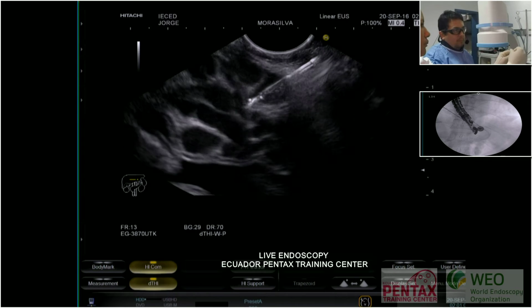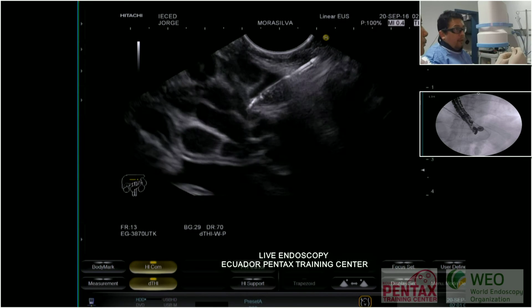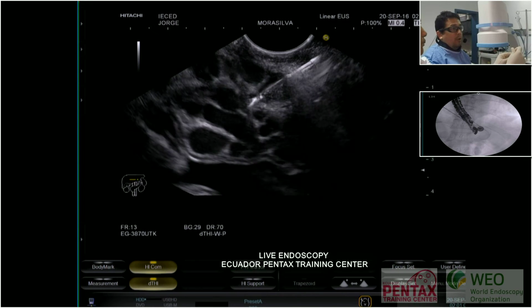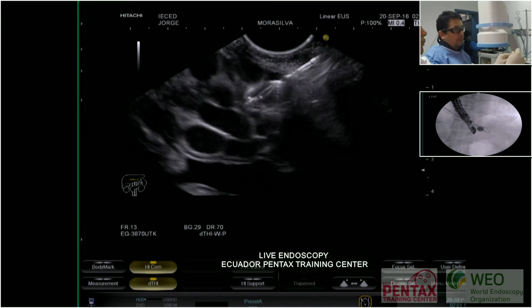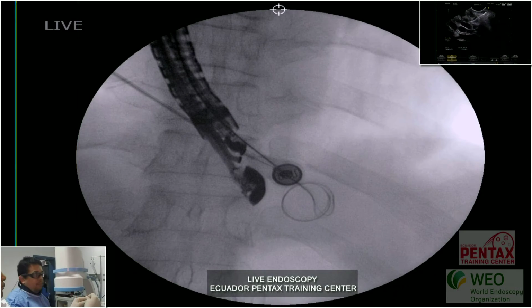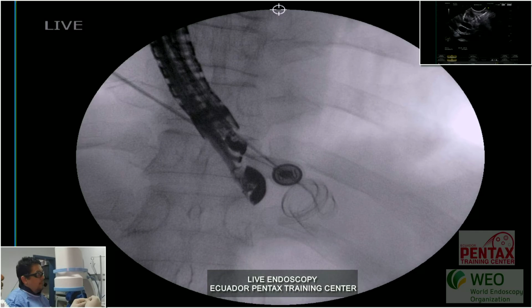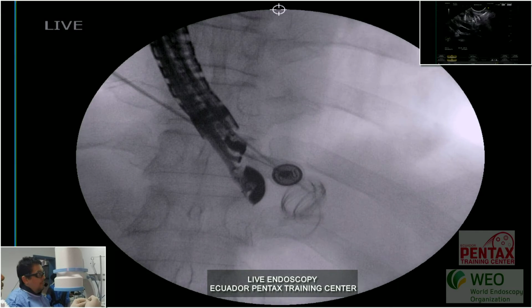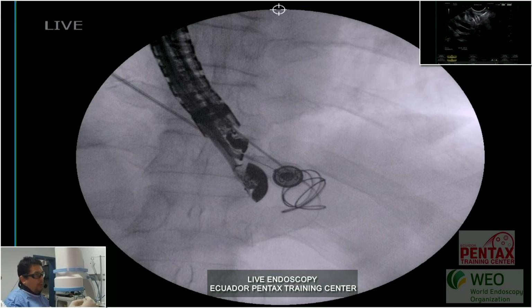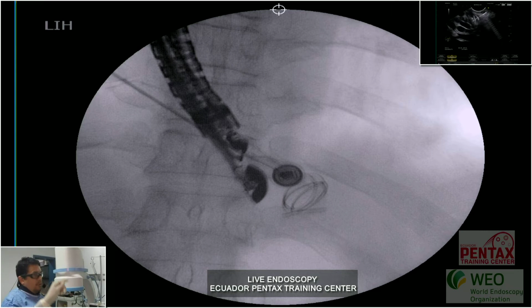Okay, momento. So I will show you by X-ray. So now by the US, the coil is going inside the varix. Okay, let's go. Go. Okay, it's okay. So there is the coil, and we can now retire the guide wire, and you can see by X-ray. Now I need to show you also by US.